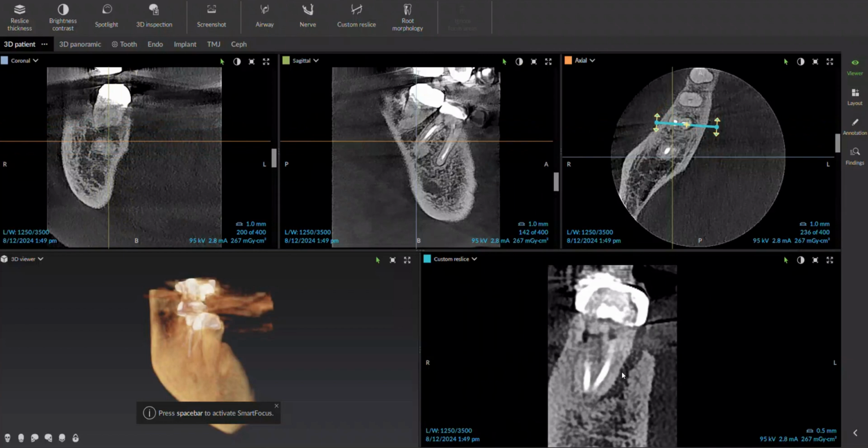So we save the patient from going to the endodontist. The endodontist may or may not have access to the CAT scan. Maybe the patient goes to the periodontist. We're very much able to kind of hit this at the pass and get the patient the treatment that they need. So I will leave it there. Let me know if you have any questions.